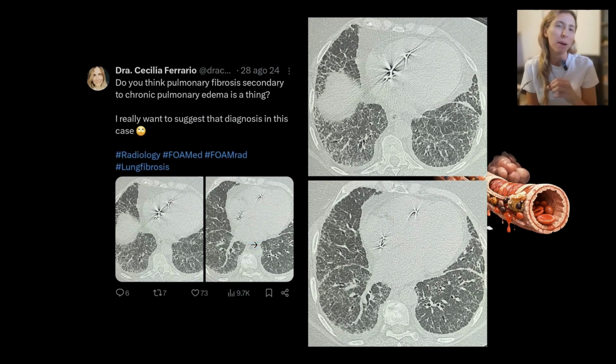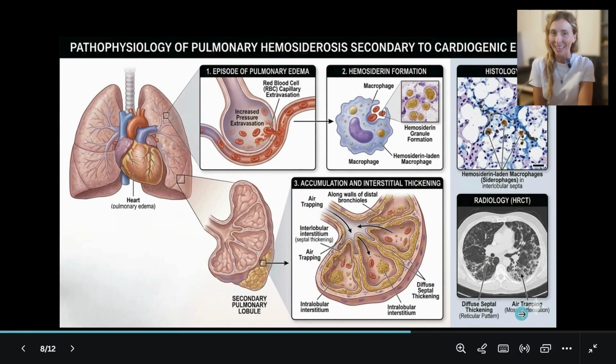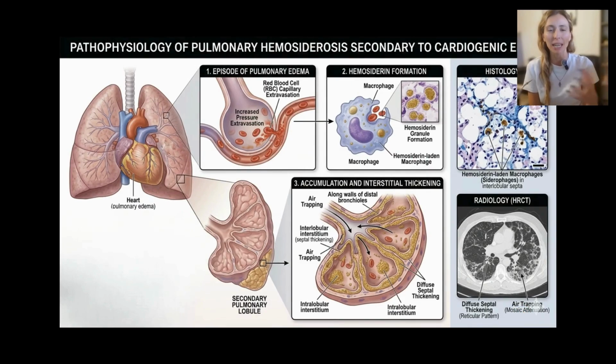I never read about it before, not as a particular interstitial pathology in CT, but I received a very interesting response from a colleague in Chile, Dr. Gutierrez, who told me that he frequently sees this in his practice, and he explained to me the pathophysiology. This is created with NanoBanana. I use this tool to create medical infographics. It is not perfect, but it can give you an idea.